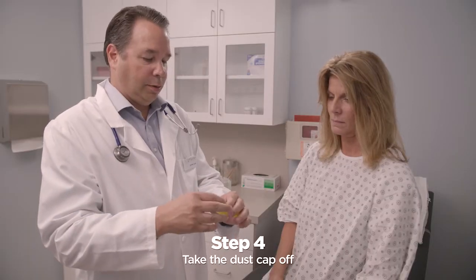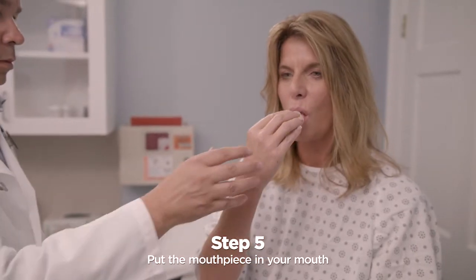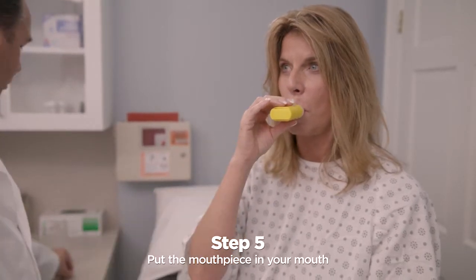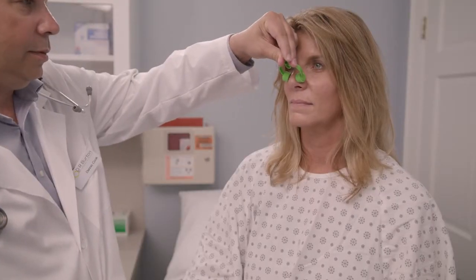Take the dust cap off the pocket PEP. Put the mouthpiece in your mouth and close your lips around it to make a good seal. Make sure your hand does not cover the holes near the bottom. Your healthcare practitioner may tell you to use a nose clip if needed.